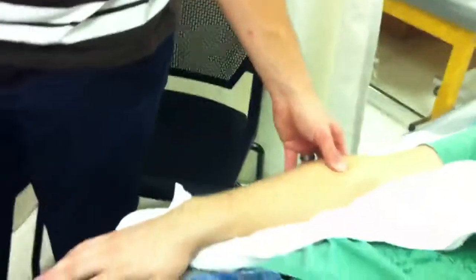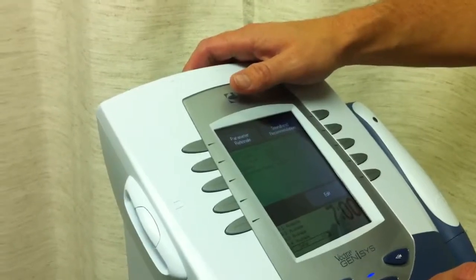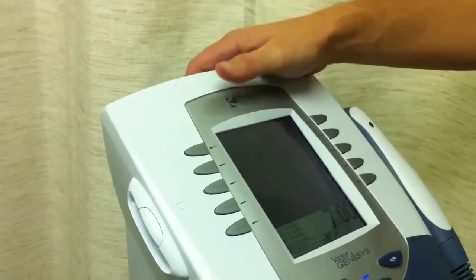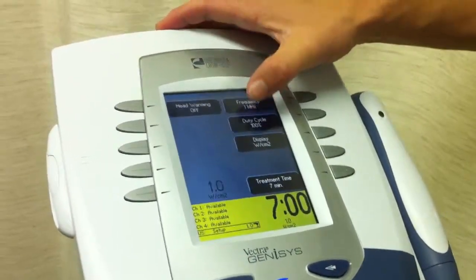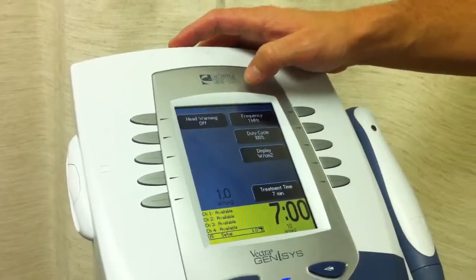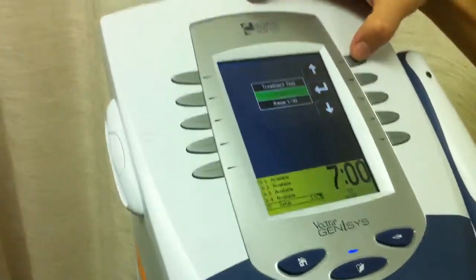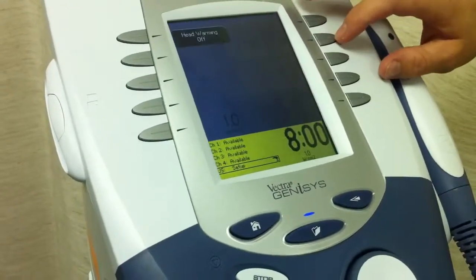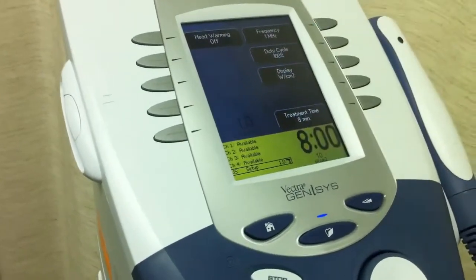Because there's lateral epicondylitis, we're trying to treat the tissue. We're going to have it on one megahertz. We're trying to get some heating because we're actually going to do some additional stretching, so we're going to have it on 100%, which is heating the whole time. We're going to have it on 1.0 watts per centimeter squared. We also need to change the time — hit treatment time and bump it up to eight minutes. Now we still have the same settings: one megahertz, 100%, and 1.0 watts per centimeter squared.